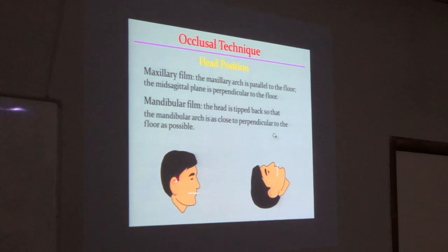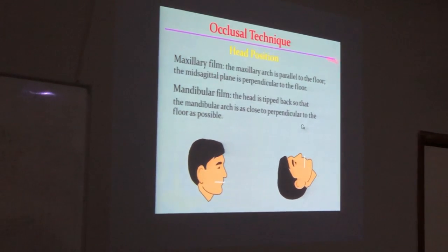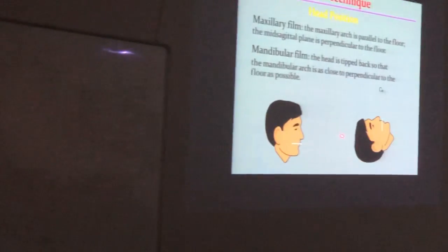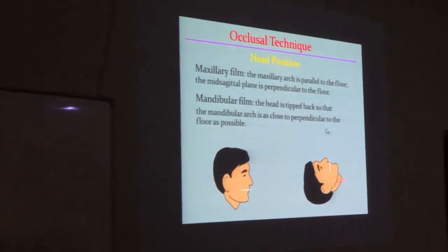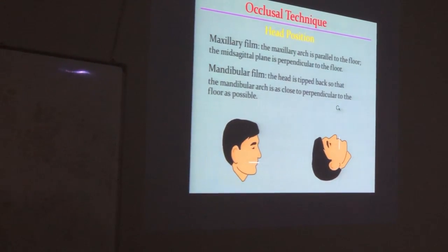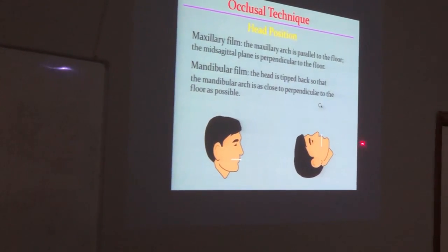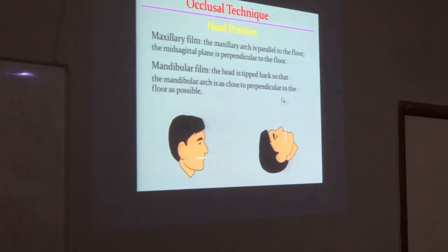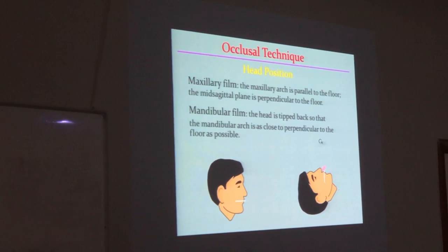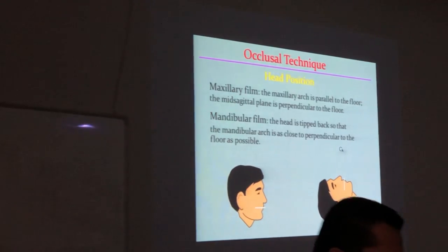If you want to take the maxillary, the mandibular film, we have to, the patient should be laid down. يعني مو هواية كل شيء تقريبا زيرو angulation شوية يعني 45 بالضبط. على مود الهيد السنترال راي يجي directly to the occlusal film. هذا بالضبط perpendicular to the film. هذا ايش ياخذ لنا؟ ياخذ just lower teeth, lower occlusal.